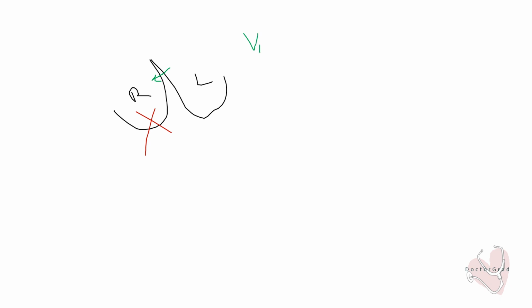You have to understand that the precordial leads are horizontal leads and the limb leads are vertical leads. So precordial leads, or chest leads, are looking at the heart in a horizontal plane. V1 is looking from the rightmost point, mainly looking at the right ventricle, we can say, and V6 is just opposite. It's looking from the left side. It is more towards the left, right? So that is one thing you have to keep in mind.